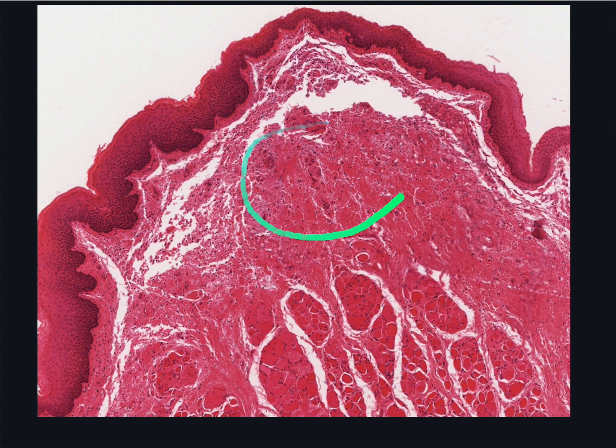Both appear in cross-section. Skeletal muscle of the vocalis muscle, cut transversely, is easily recognised with the muscle fibres having peripheral nuclei. But the ligament, just under the epithelium, is a bit trickier to identify as being collagenous with the nuclei of fibroblasts scattered about.